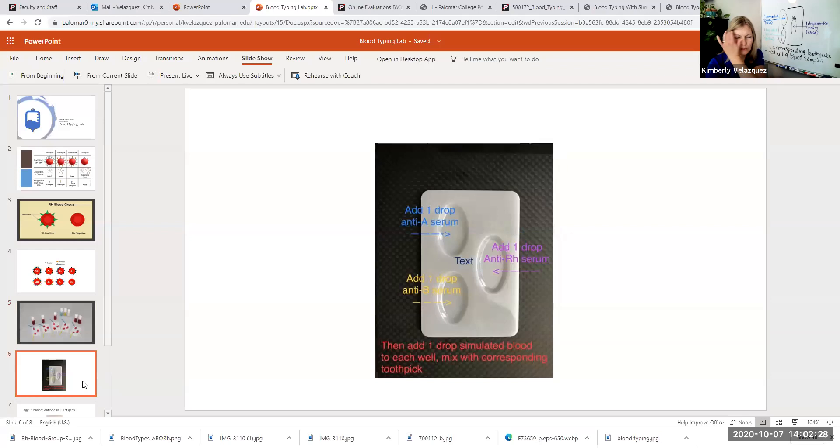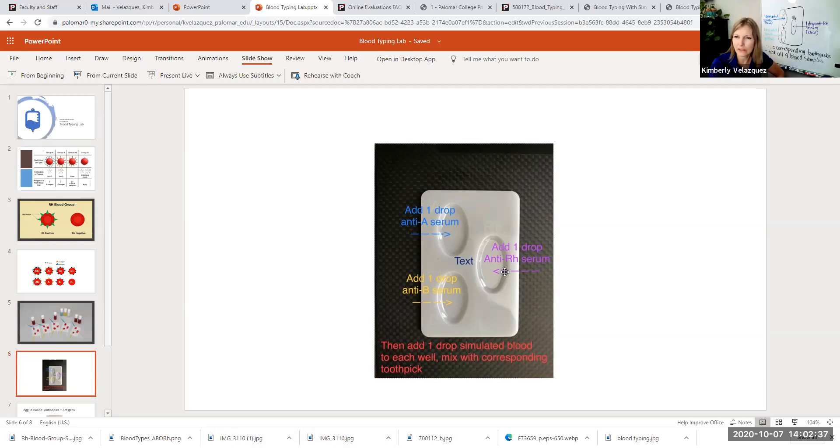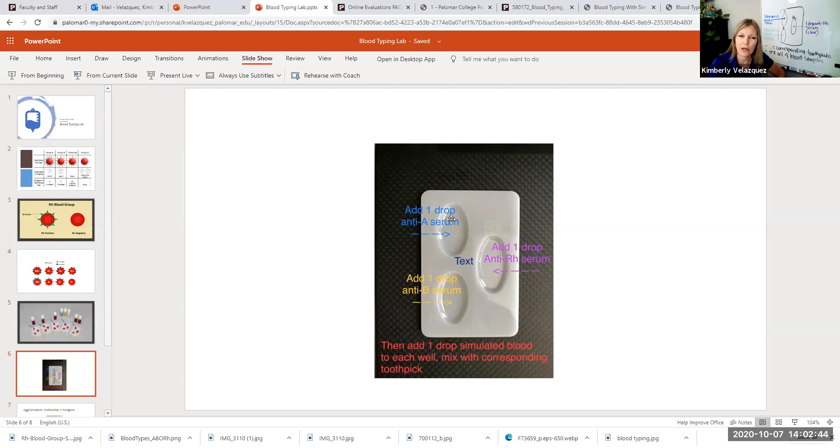So this is what your test well looks like. And for each of the tests that you're going to run, you're going to follow the same procedure. First thing you're going to do is you're going to set up your test well with the anti-serums in each of the appropriate wells. So the anti-A serum, one drop is going to go in the top well that's labeled A.